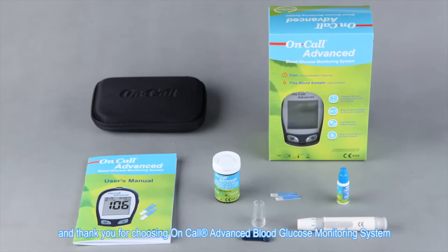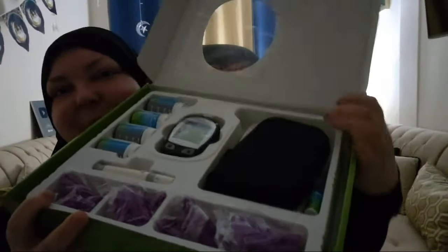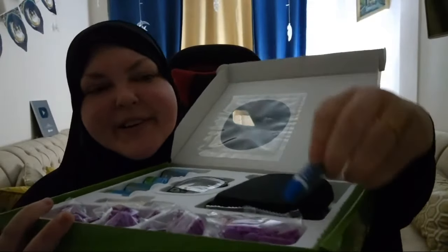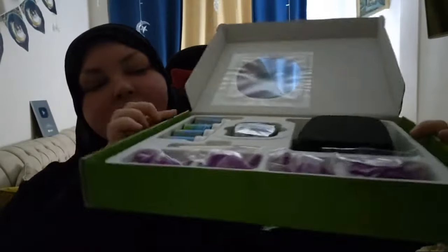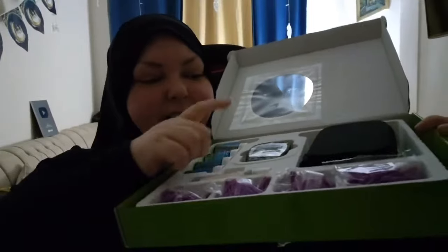The device says: 'Welcome and thank you for choosing the On Call Advanced Blood Glucose Monitoring System. This video will make you more familiar with the system.' So it comes with this little thing — I don't know what that is for — and all of these are lancets, all of these are strips, 100 each, and the lancer and the machine.